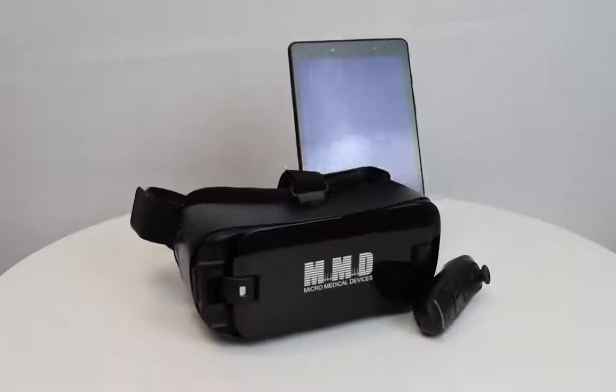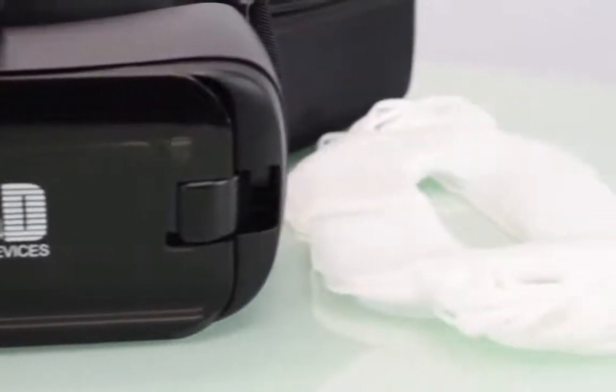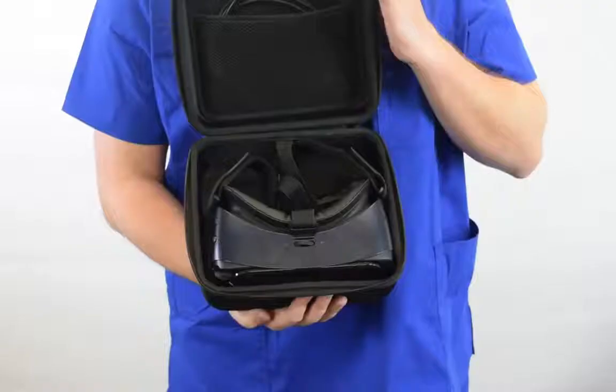Inside the case, you'll find the VF2000, a controller, a compact charging system, and disposable face shields to make using the device with patients even more sanitary.